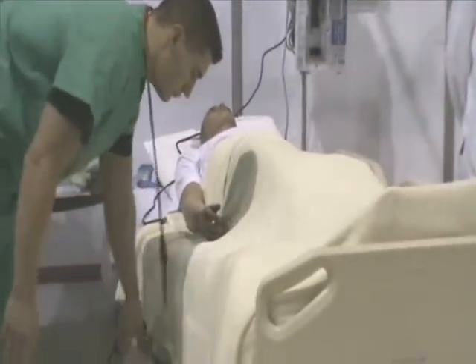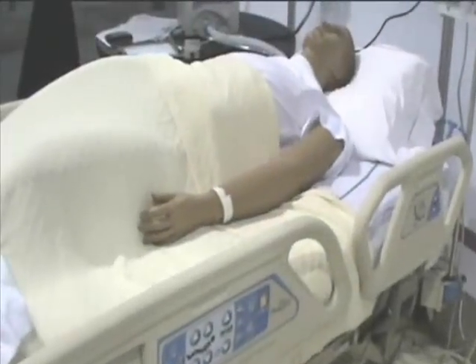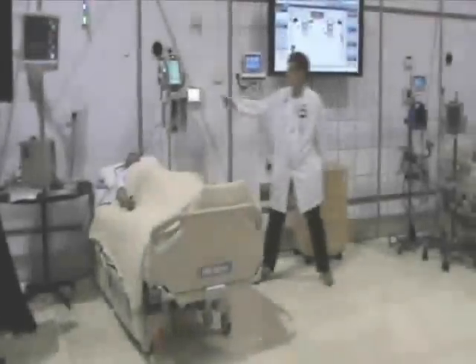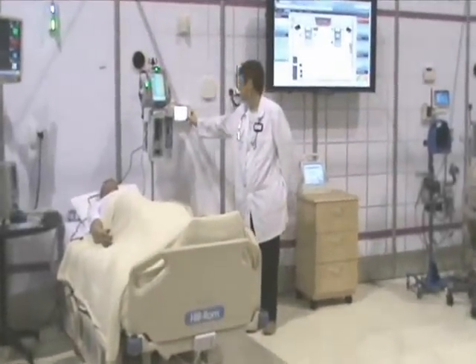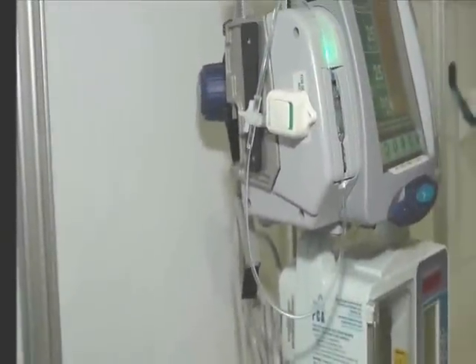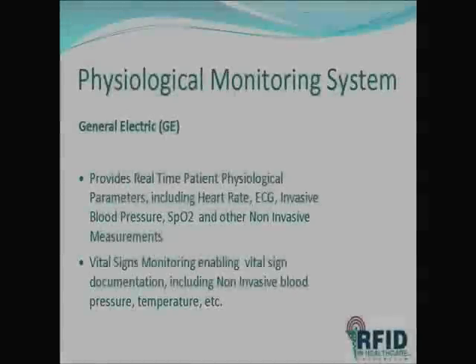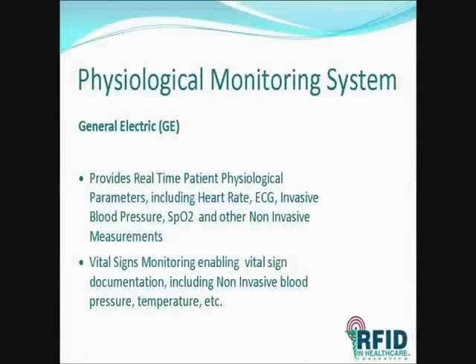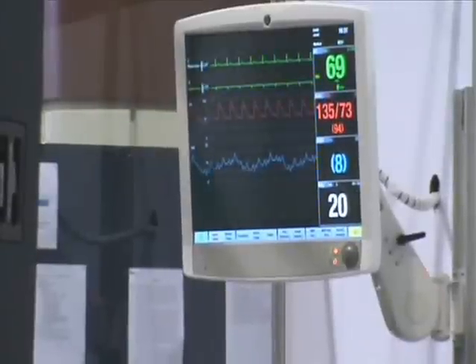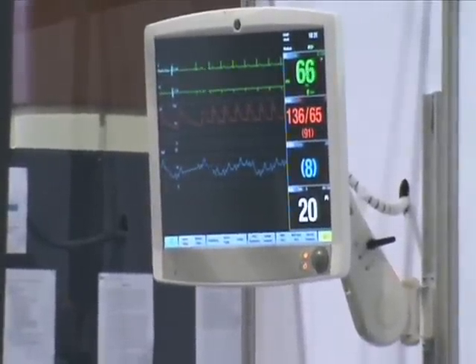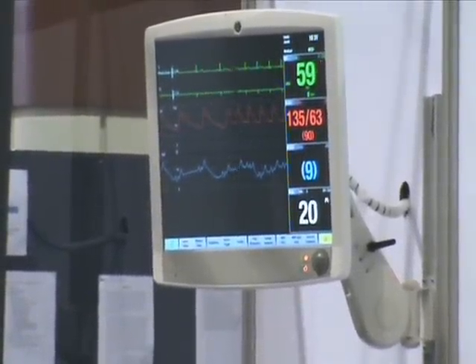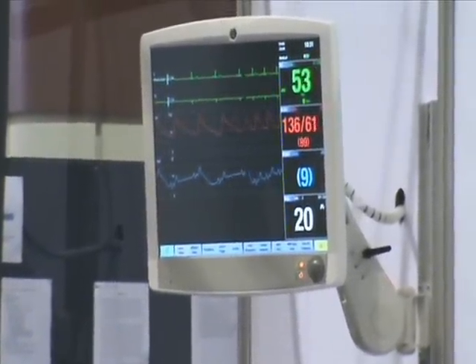The bed rail status information is displayed on the board. The patient's physiological parameters are tracked on a network-based, high-acuity system, presenting real-time measurement, visualization, and dissemination of critical parameters. In this case, we are continuously monitoring ECG, heart rate, blood pressure, and pulse oximetry, triggering alarms when there is a deviation from set parameters.